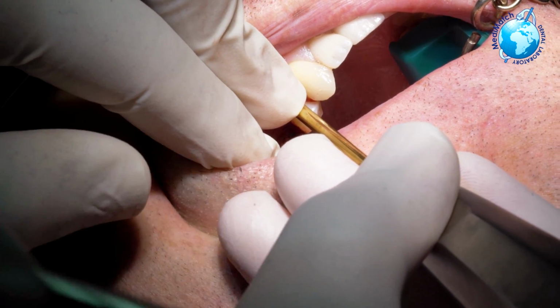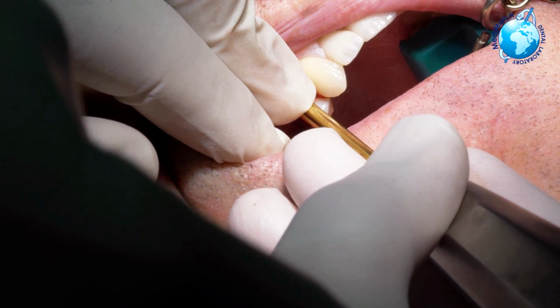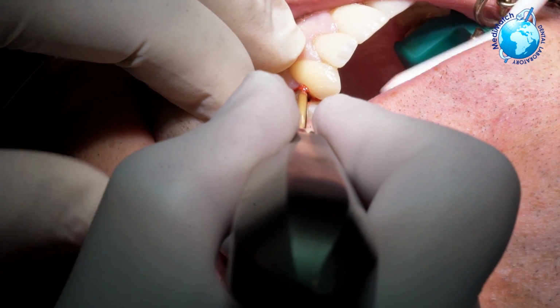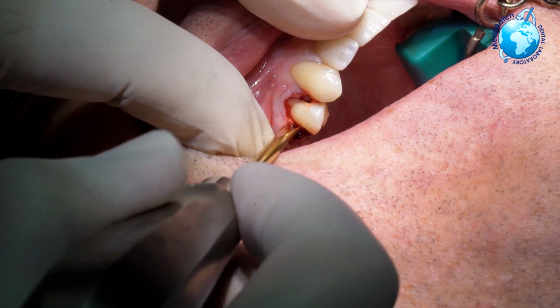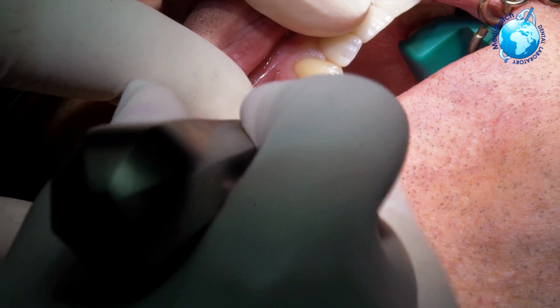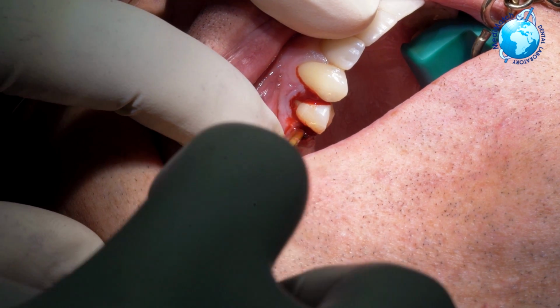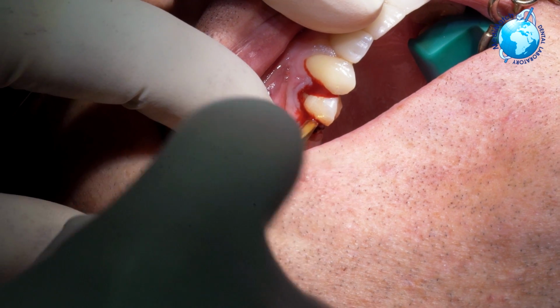Alan, little tap coming up. Okay. So perfect, thank you. The retracted taps, and just a nice bit. So again, patience, time and pressure. Nothing's being forced here between these teeth coming out. Okay, that's awesome. So I'm still just leaning on that tooth, taking my time with that, just all from the buccal.